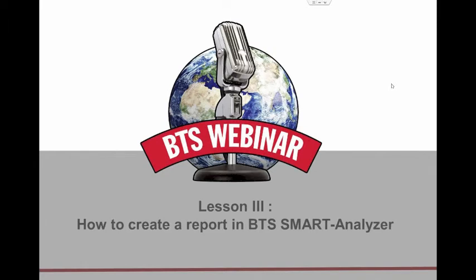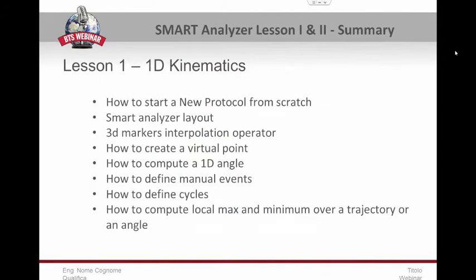Good morning to everybody. Now we are going to start with the third and final theoretical lesson over the BTS SMART-Analyzer application, where we will finalize our analysis protocol into a complete report. Before starting, just a quick summary about what we have learned during the previous two lessons.